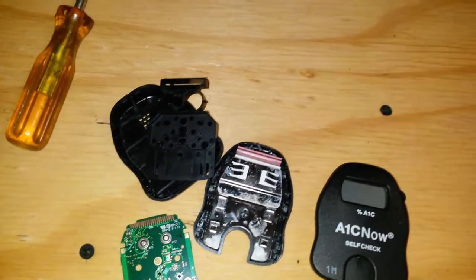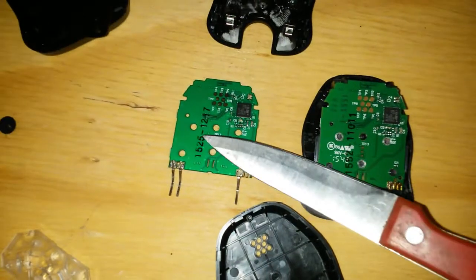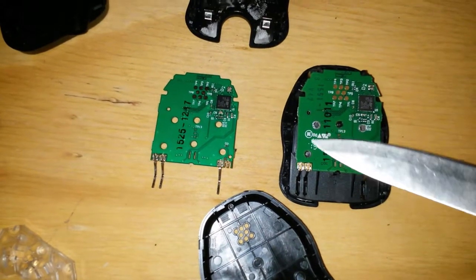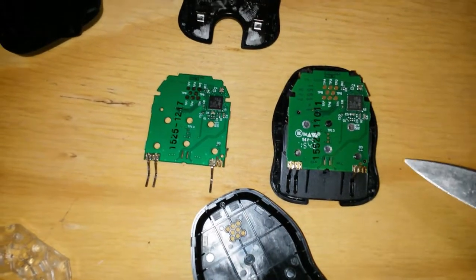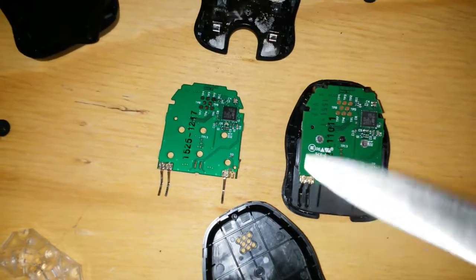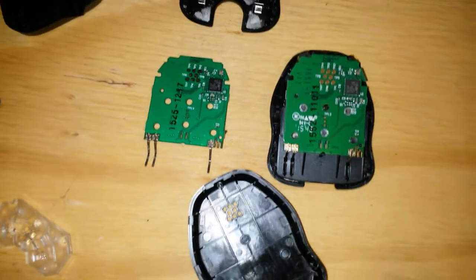So let me pop this one open, get some pictures of that. As I pop this open, you can recognize here this number, and this writing here is different on this one. So different version, different time of manufacture for sure. Nothing else looks different, but at least somebody revised something along the way.